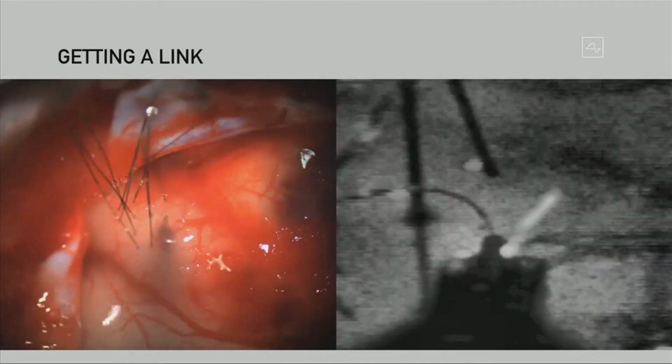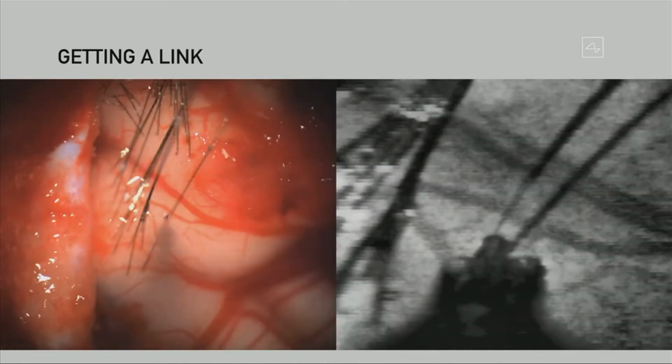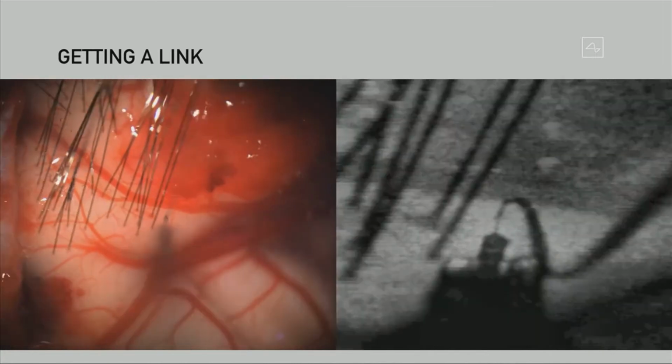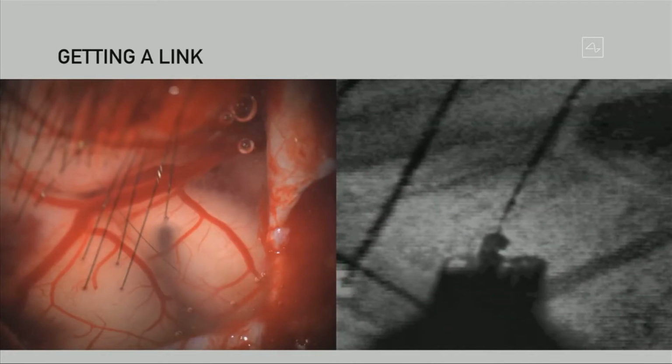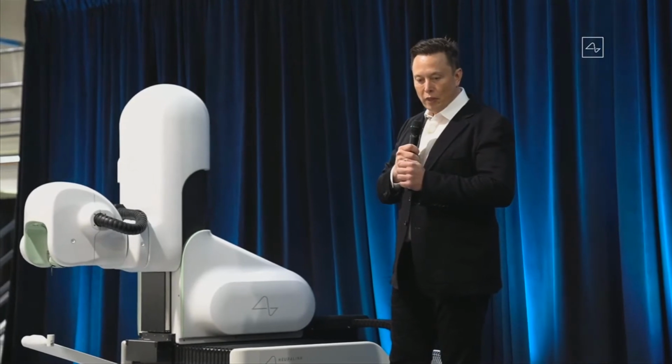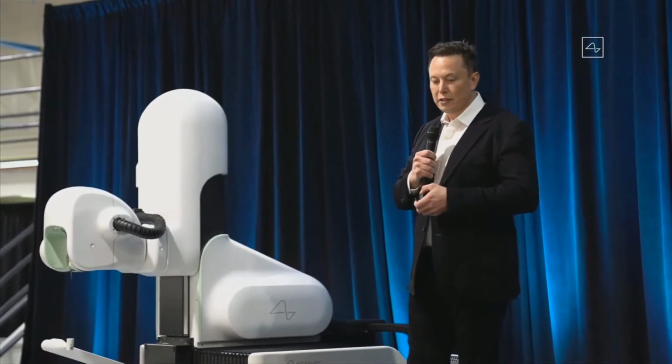This shows you a close-up view, which I think is not too gruesome, of the electrodes being inserted in the brain. If you look closely, it's a little counterintuitive, but if the electrodes are inserted very carefully, there's no bleeding. If you have very tiny electrodes, inserted carefully, so that the robot images the brain and avoids any veins or arteries, they can be inserted with no noticeable damage. You'll have no noticeable neural damage in inserting the Link. You sort of think that if you stab something with a wire, surely it will bleed, but at a really small scale, it does not.